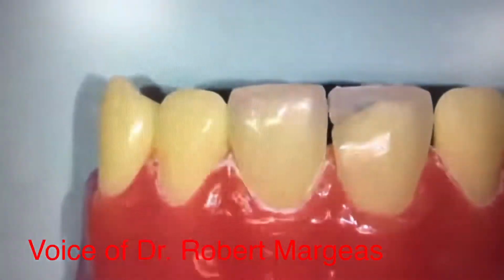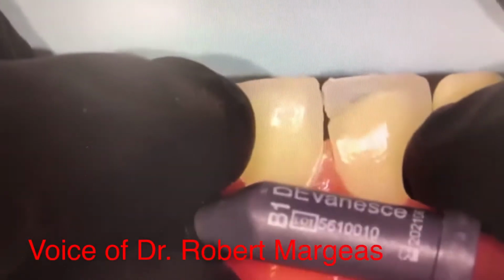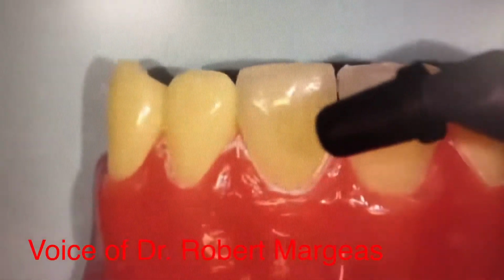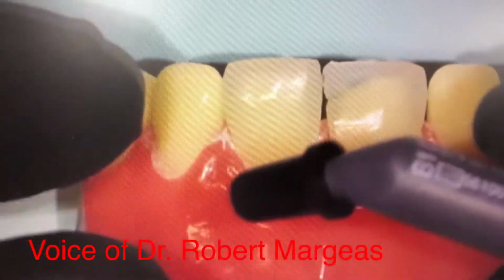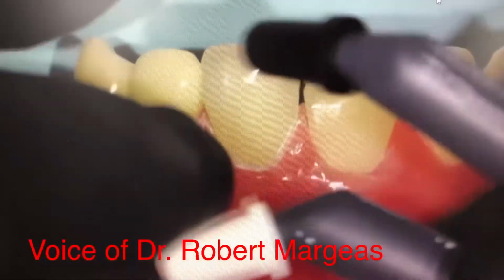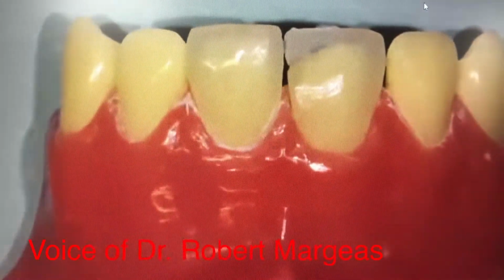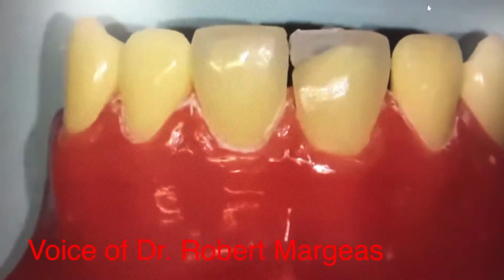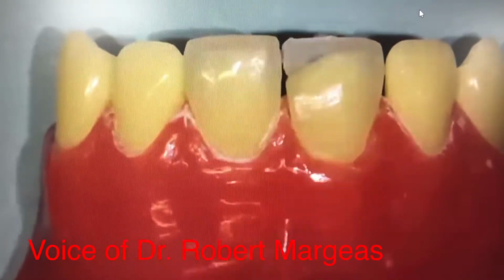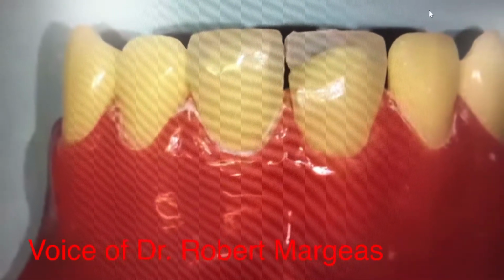So what I'm going to do now is I'm going to take my dentin shade, B1D. If you look at these different caps, the dentin is dark, the enamels or achromatic enamels are white, and the universal is gray. That's the way you can tell the composite, the darker one being the black. So I'm now going to take my dentin shade and I'm going to place that onto the bevel.